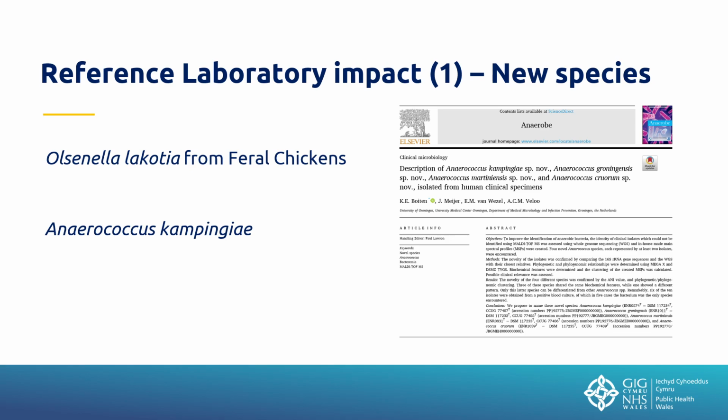This is Anaerococcus from the Dutch group that Linda Bruul leads, and here they've discovered a new Anaerococcus from their processing, which is similar to ours, of using MALDI-TOF initially, and then 16S sequencing, and then for those that they see consistently from certain infections, they've managed to associate together and discover and name the new species.